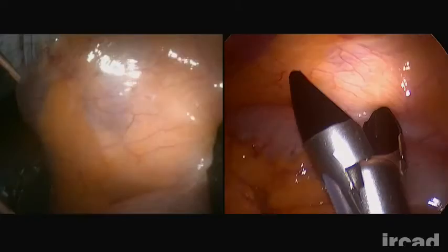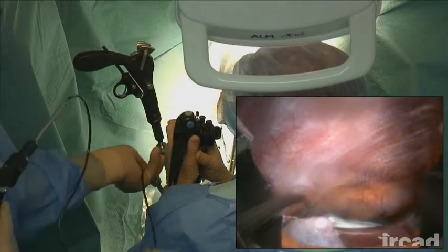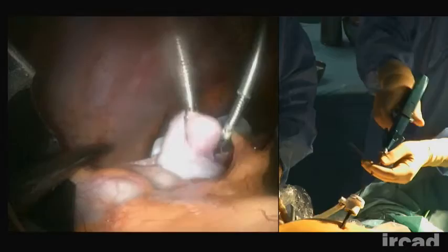The Anubiscope consists of a flexible 110 cm long four-way articulating endoscope with a 16 mm articulating vertebrae section and an 18 mm distal tip. The distal head, shaped like a trocar, incorporates two opposing movable arms with two 4.2 mm working channels and a central 3.4 mm channel.